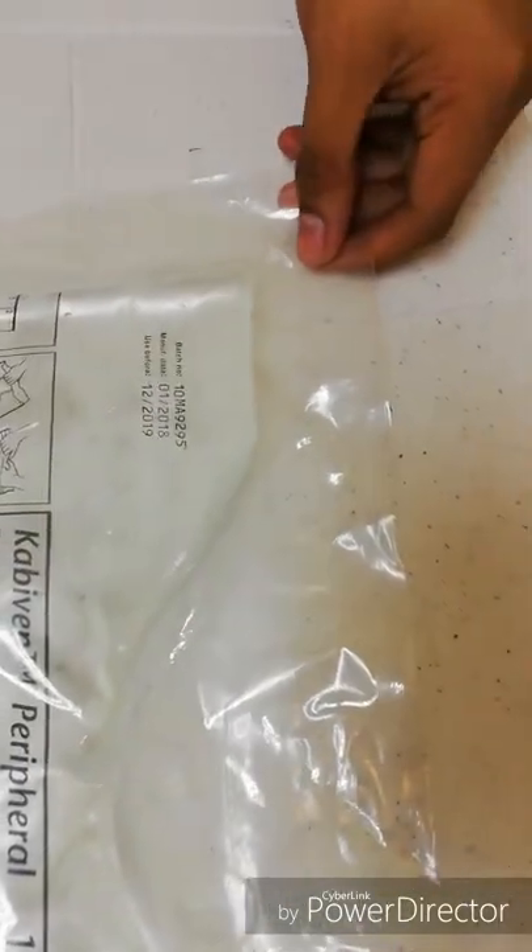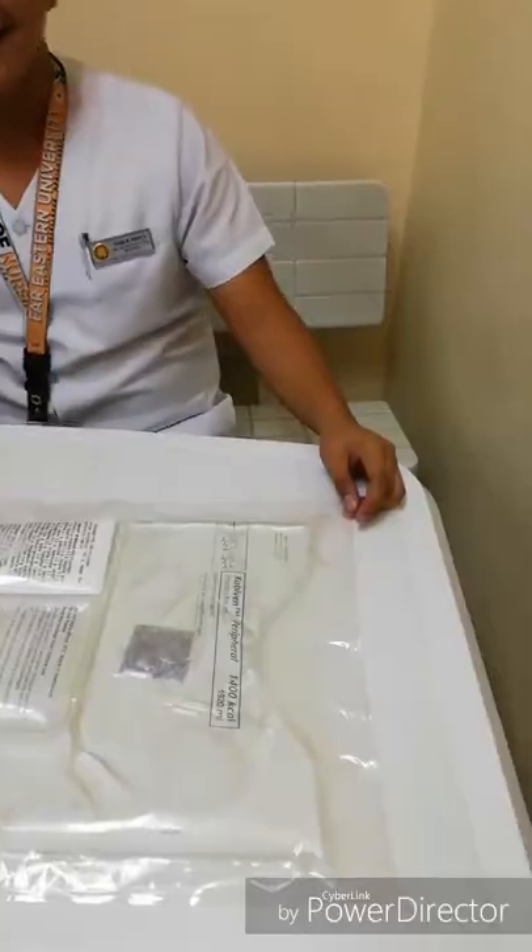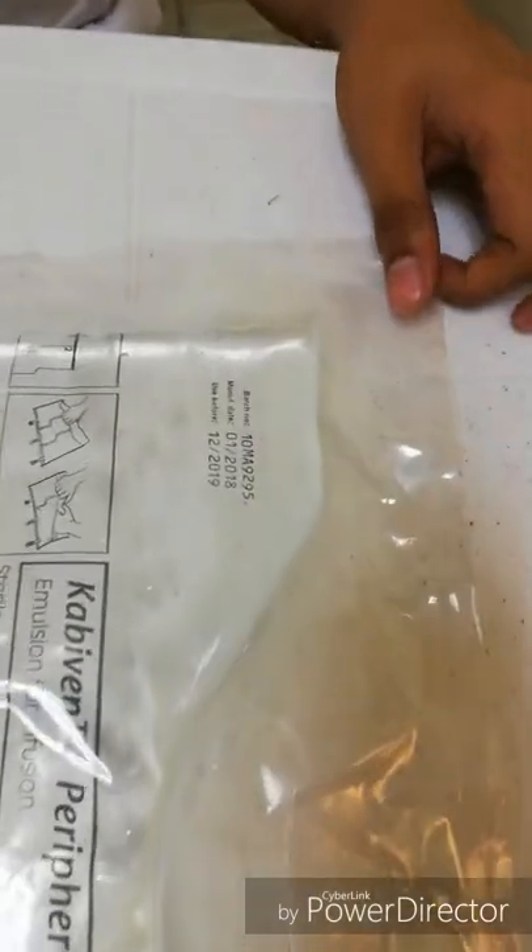The next thing we will do is unpack the TPN. Now I will be validating the expiration date — use it before December 2019.